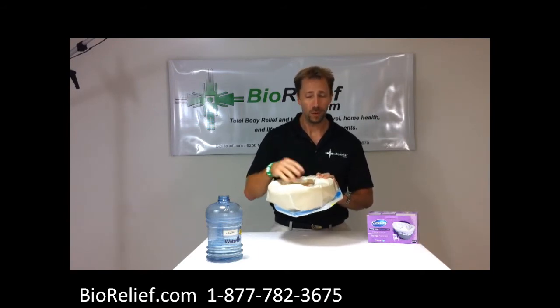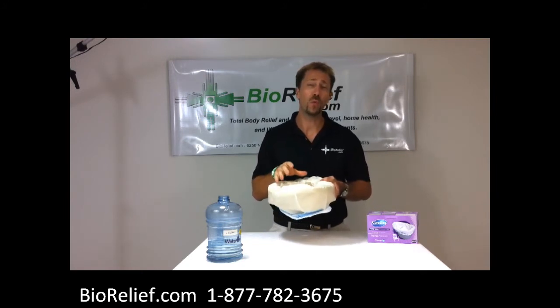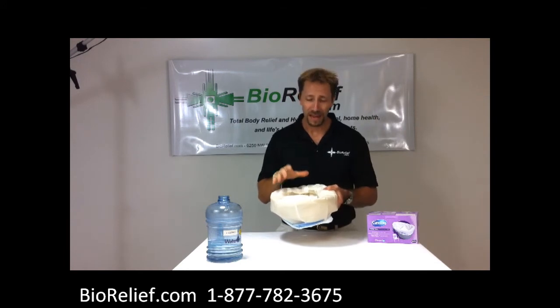It just absorbs a lot more. The best thing about this is that once feces or urine hits it, it turns it into an odorless solid in about 20 seconds. That makes it safe for disposal, and it's safe for the environment to dispose of.